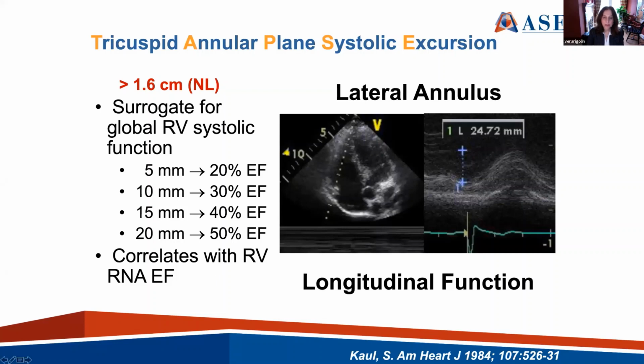Remember that this is dependent on correct alignment of the M-mode cursor. So look at how this image is tilted, so that we try to get the best approximation of this tricuspid annulus. So there are some limitations in terms of technique.